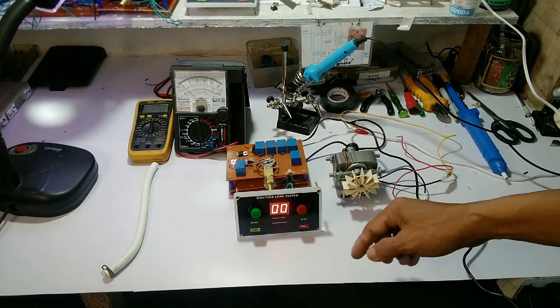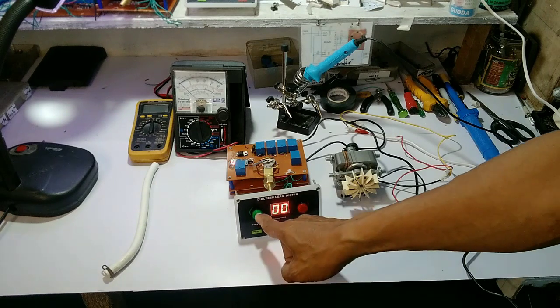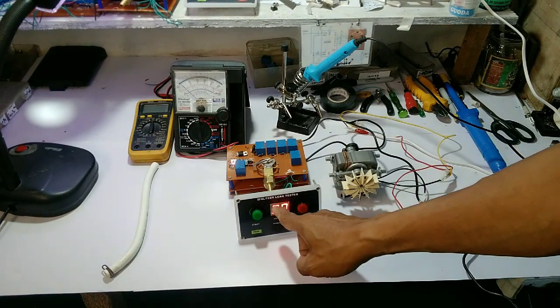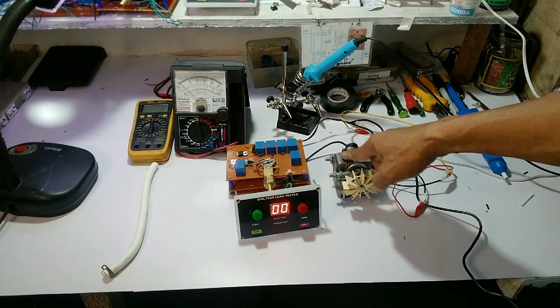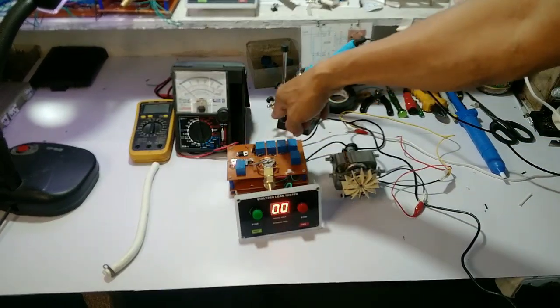Ito po ang actual na unit ng ating dialyzer leak tester. Makikita nyo po sa panel ay ang start button. At ayun, ang start button ay aandar po ang air pump. Iyon naman ang kabuo ng ating controller.